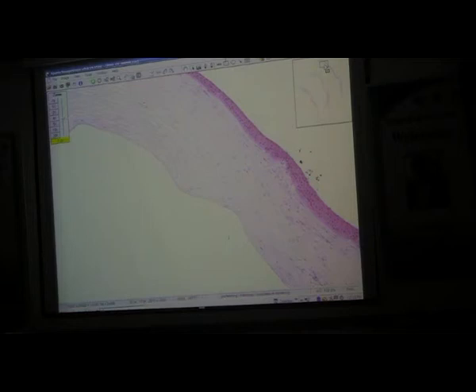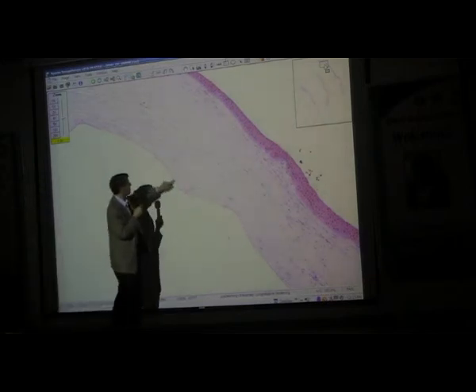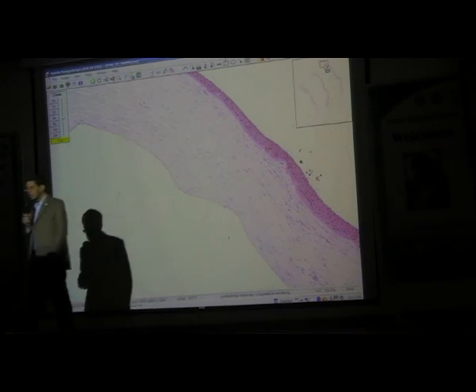I'm sure that there are ideas, but you are tired, so I'm going to give you some suggestions. You're not tired at all? I'm not tired at all either. Do I look tired? Alright, let me answer this. The cornea is normally dehydrated. Yes, what is maintaining the dehydration state of the cornea? Everybody knows, yeah? Endothelial cells. There's a good complement of endothelial cells here. See, endothelial cells. Oh. So that can't be the answer to it.